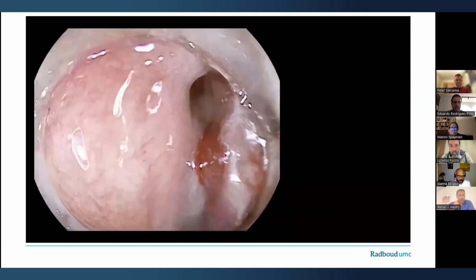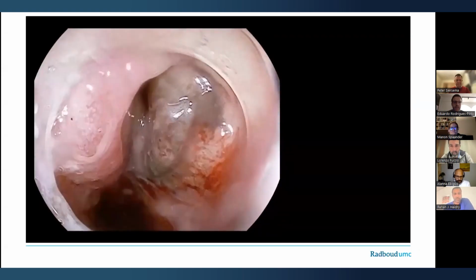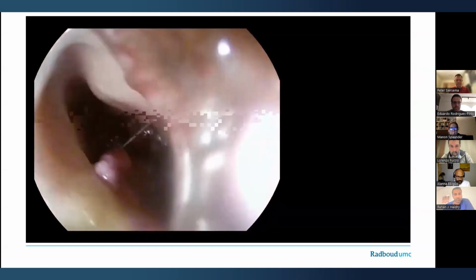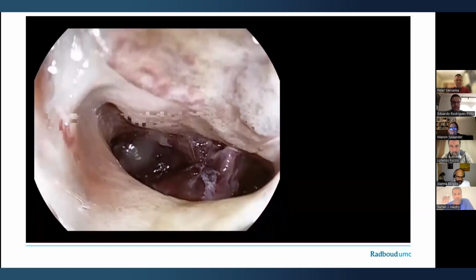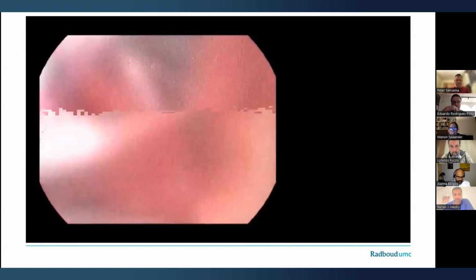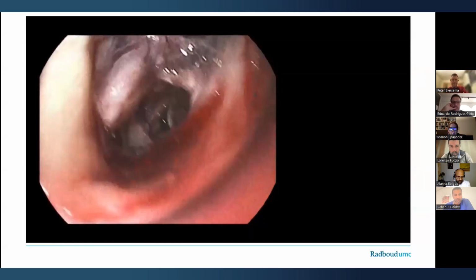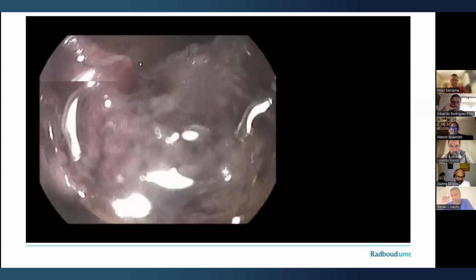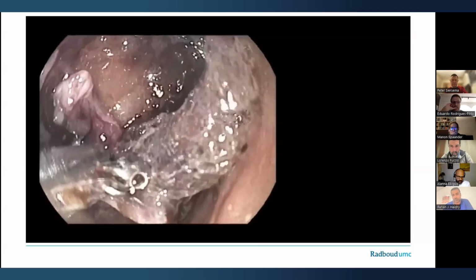Yeah, and I might allude to some of that. So this is a patient with a Boerhaave, a patient with alcoholic dependence who presented. And it's really important, Peter, as you said, that there's no need to close a hole just because we can. So this is a patient who presented 7 days later. You can see the defect here. And the first thing that is important is to get into the mediastinal cavity. This patient has an intercostal drain in, so I'm comfortable going into the mediastinal space.